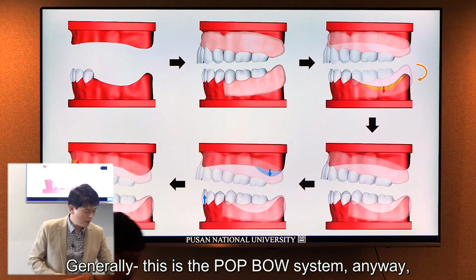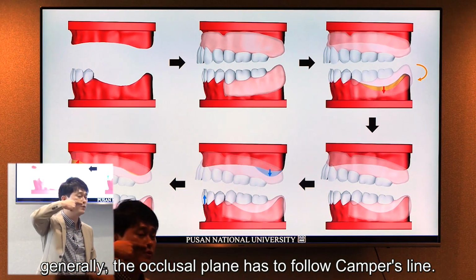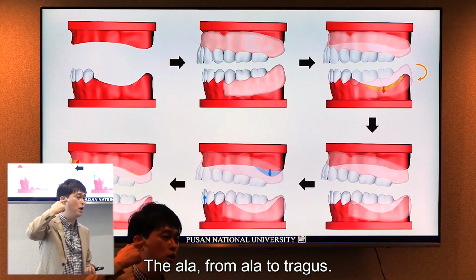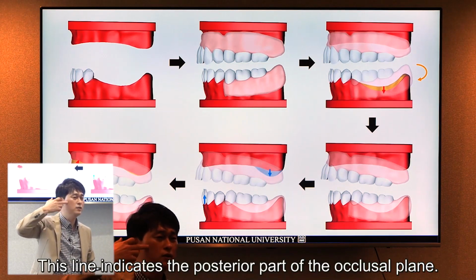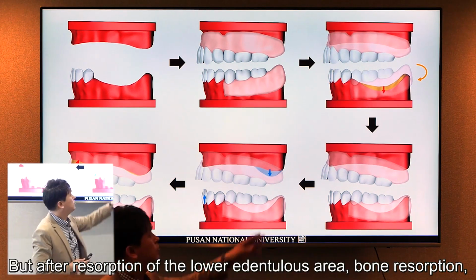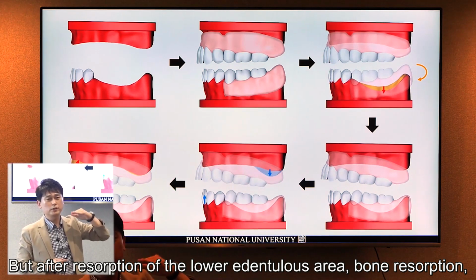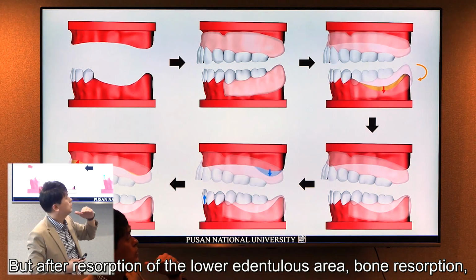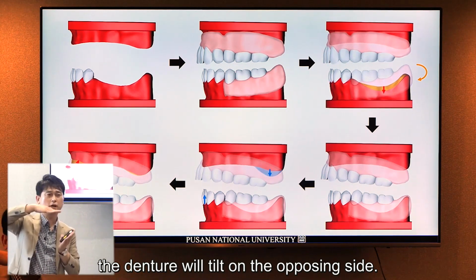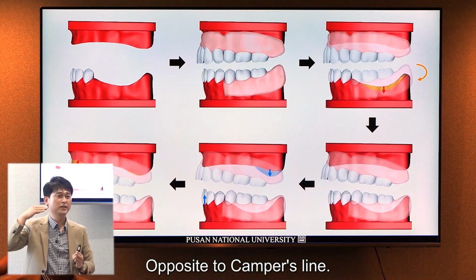Generally, anyway, the occlusal plane has to follow the Camper's line. Do you know Camper's line? From the ala to the tragus. This line indicates the posterior occlusal plane. But after bone resorption of the lower edentulous area, the denture totally tilts in the opposite direction to the Camper's line.